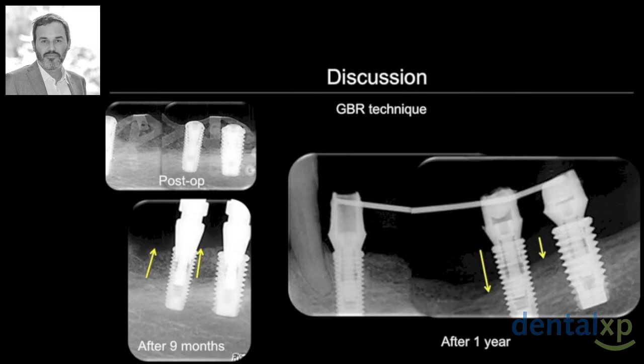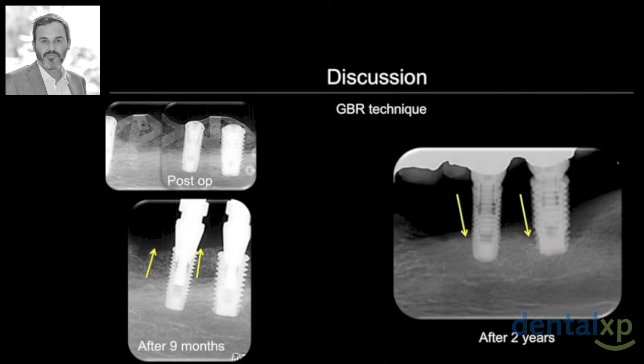1 year after loading, what has gone wrong? What happened? Look here. I have lost more bone. About 2 years, again, what has gone wrong?